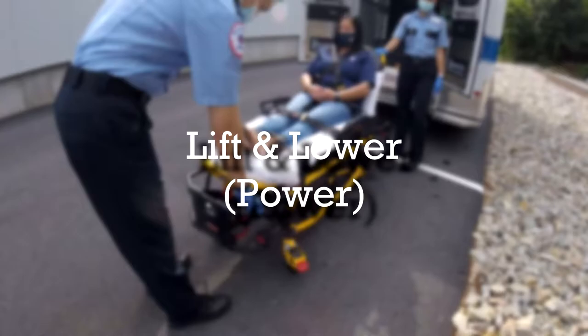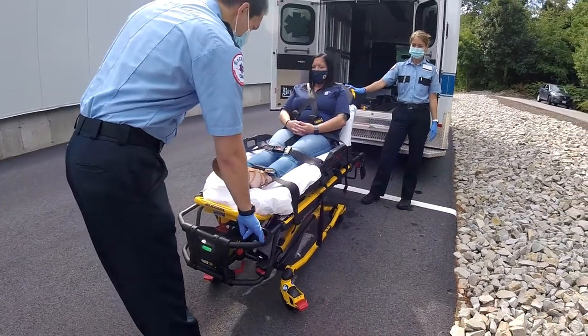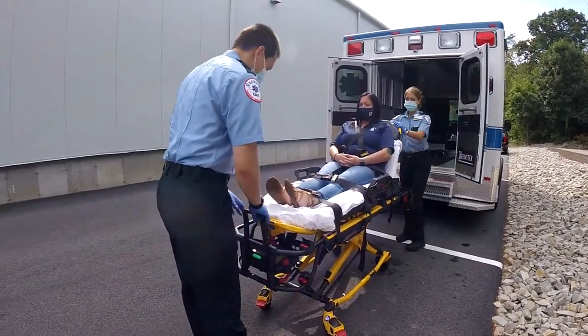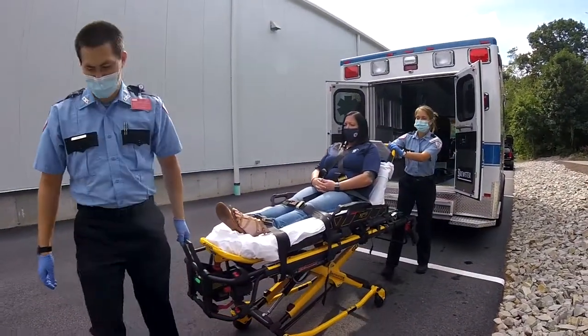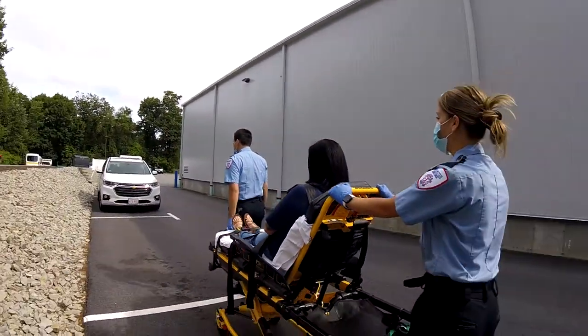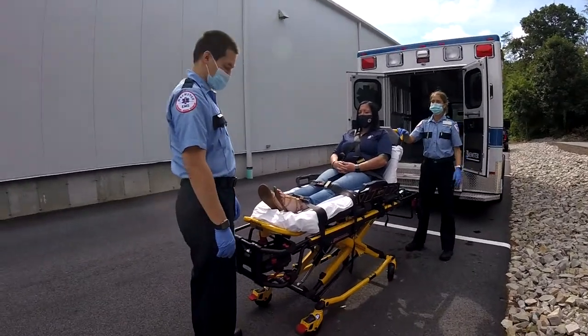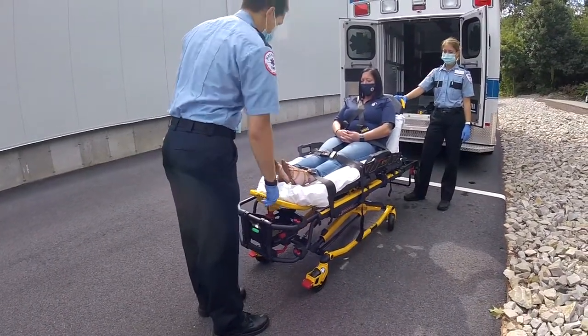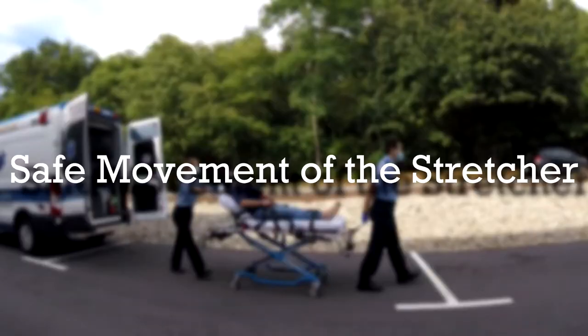When raising the stretcher, waist height on the average size human is a good reference for transporting height. Because the power stretcher is significantly easier to raise and lower than the manual stretcher, it is important to set the transport height using good judgment and common sense. An appropriate transport height is between 2 to 3 clicks down from unloading height.